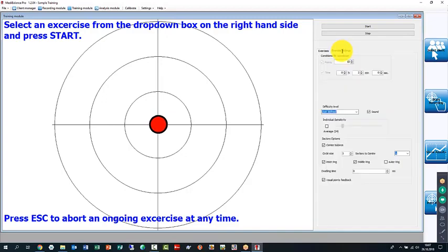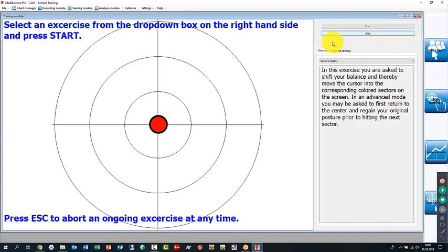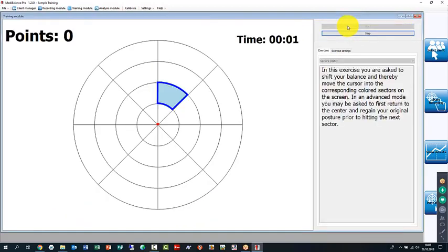If I want it more difficult, I can just go to difficult and restart it. And now you'll find that I need to lean forward more. Now there may be some easy ones, but the center of mass is very small. I need to lean forward all the way and so forth. And it's a lot harder to hit the center of origin, center of mass perfectly here.